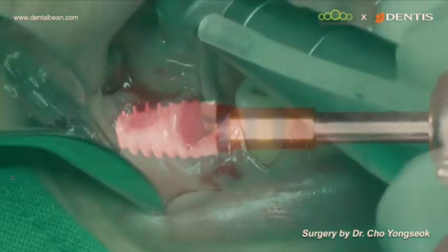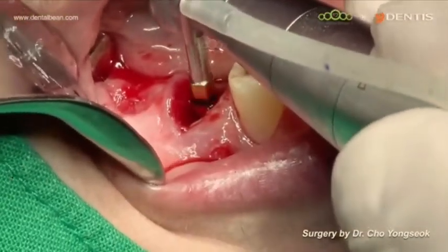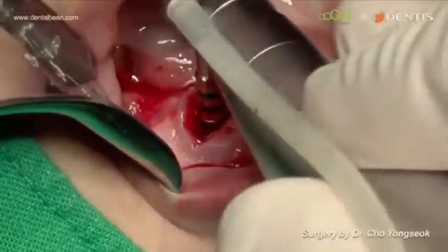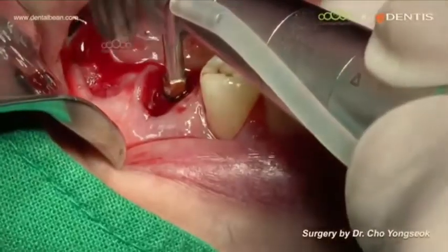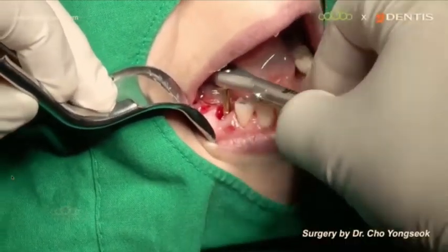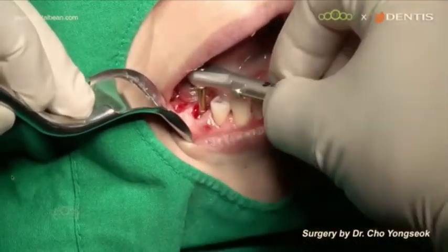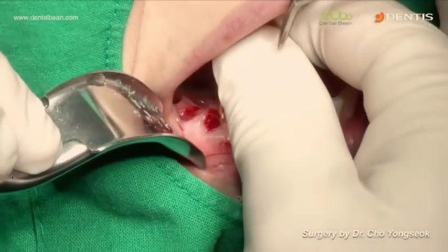Here, I selected a short implant, and placed it. Okay, I can get stability at the apex. Strong primary stability, you can see. More than 6 millimeter deep, I think.